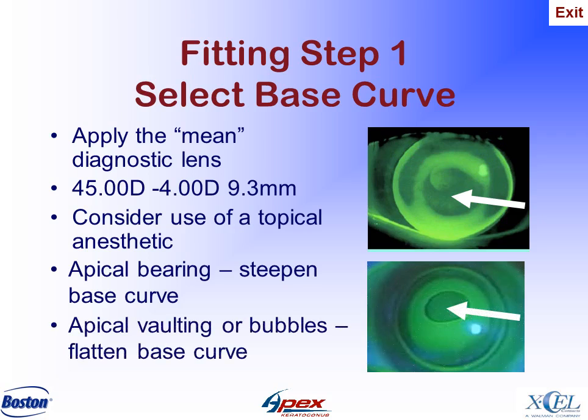If the corneal apex is vaulted or a bubble is observed trapped beneath the lens, then the recommendation is to flatten the base curve.